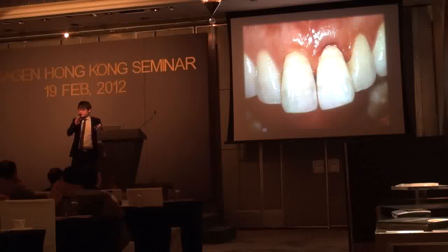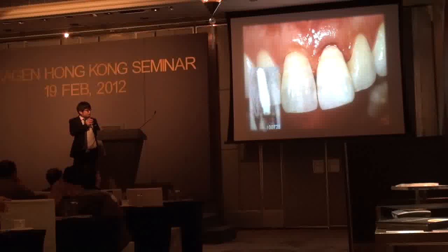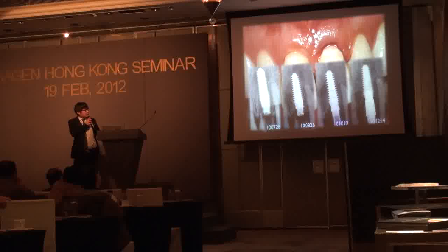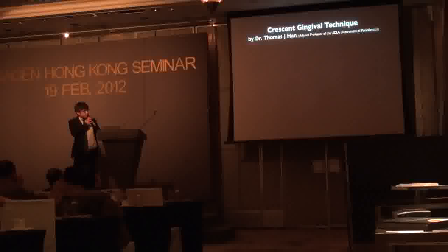Of course, the dental technician should make it like a natural tooth for the final restoration. So probably the dental technician doesn't like to do these kinds of things. So that is the final restoration of this clinical case.